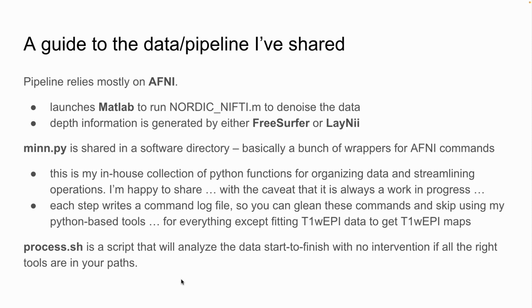But it is game changing. My data just have twice the signal-to-noise ratio they used to after they come back out of NORDIC. And I cannot see any evidence for spatial smoothing. I cannot see any structure to what's changed in the data. I just have twice the signal-to-noise ratio after I run NORDIC over my data than before.